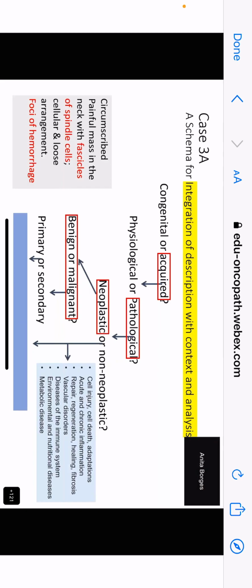So I must say, Vimi, you made the diagnosis of schwannoma. That is excellent. So this is a schwannoma. It is not a lymph node. There was no lymphoid tissue over here. It was circumscribed, yes. But many things are circumscribed and they're not lymph nodes. So what actually is the diagnosis? It is a schwannoma with degenerative changes.